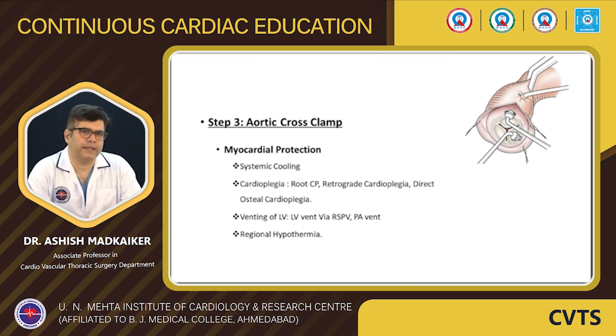The appropriate method of cardioplegia again depends on the surgeon as well as the primary pathology that we are dealing with. When a patient has aortic stenosis, we might be okay to give root cardioplegia. However, with aortic regurgitation, it may not work well, and either direct ostial cardioplegia or retrograde cardioplegia would be an appropriate approach.